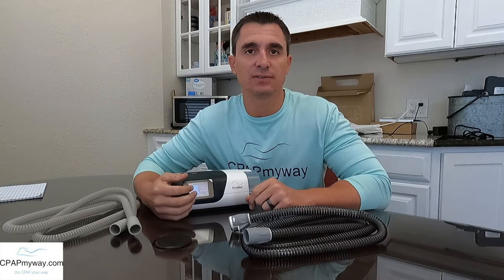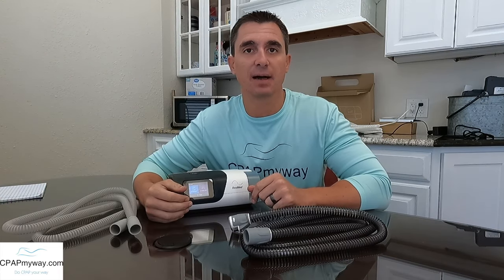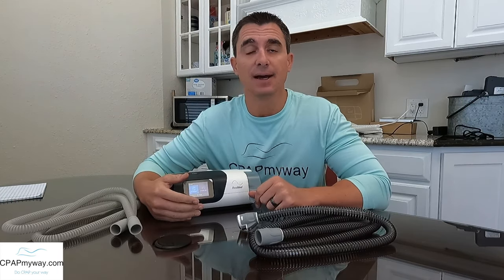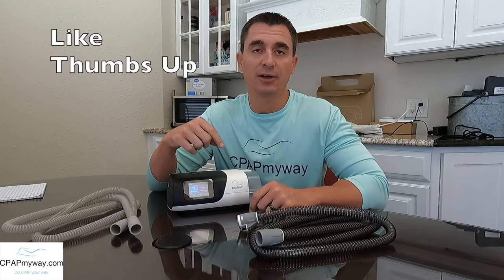We get questions from our customers as well as a ton of comments on YouTube about humidity, how to get the best humidity, do you need a heated tube? In many cases, you're getting one with your CPAP when you first get a CPAP, so why do you have it? Could you do without it? What are the pros to it? What are some of the drawbacks to it? So I'm going to jump into that here.